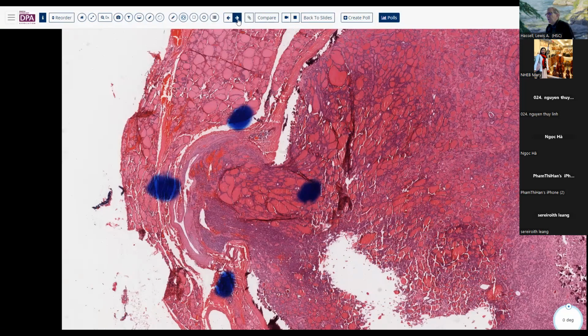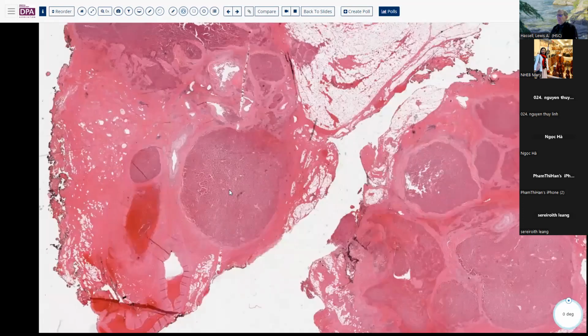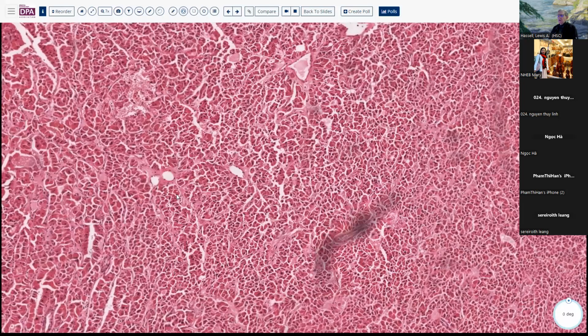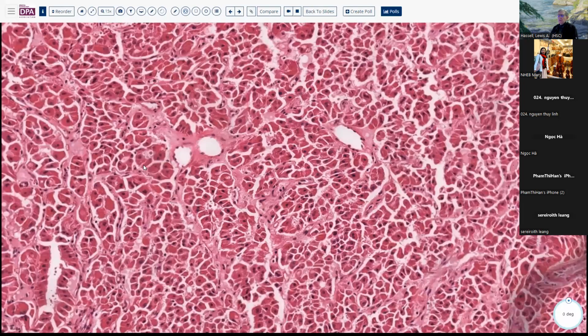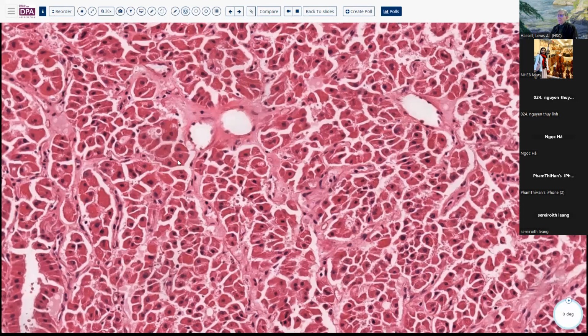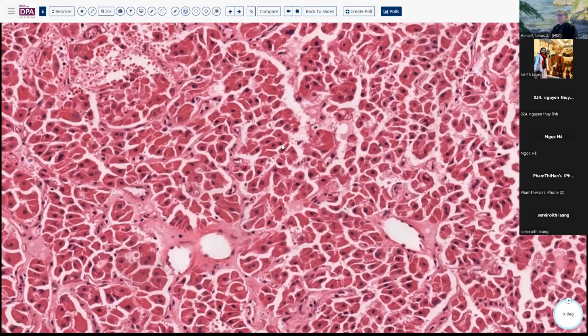All right, let's move on to a more clearly invasive lesion, and one that usually is not a terrible diagnostic problem. This is another variant of follicular carcinoma, the so-called Hürthle cell variant. You can see these very oxyphilic cells here, and these can look very bland, as you see here. Lots of cytoplasm, generally fairly uniform nuclei, and so forth.